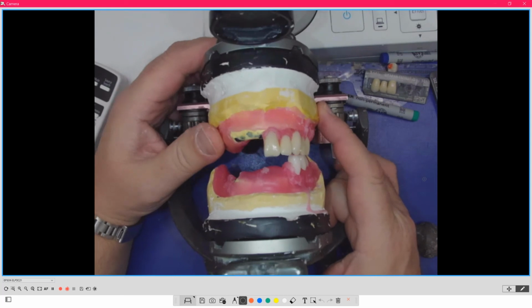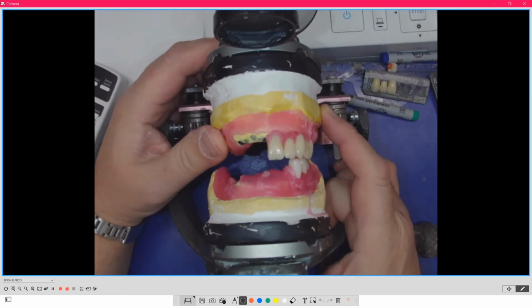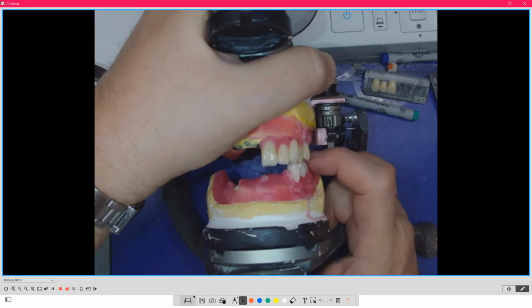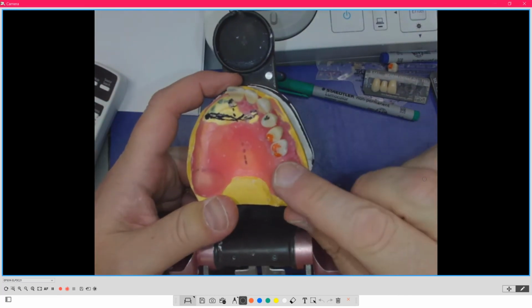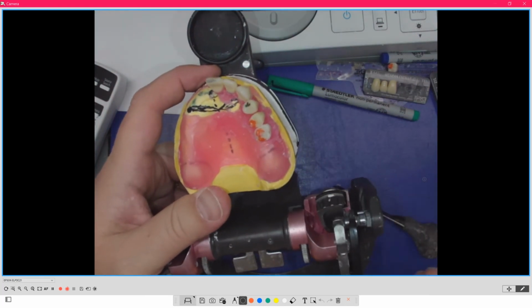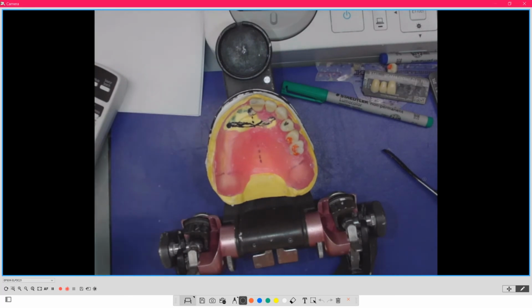I want you to do this and start moving your articulator. I don't care what articulator it is. You can move it like this. Sure, you might have to grab it and work it a little bit, but I want you to start to now move the tooth, okay? And move things. And then what you're looking for is to see how the teeth are functioning within that chew cycle. So allow me a moment. I need to lute everything down and I'll show you how to calibrate it.